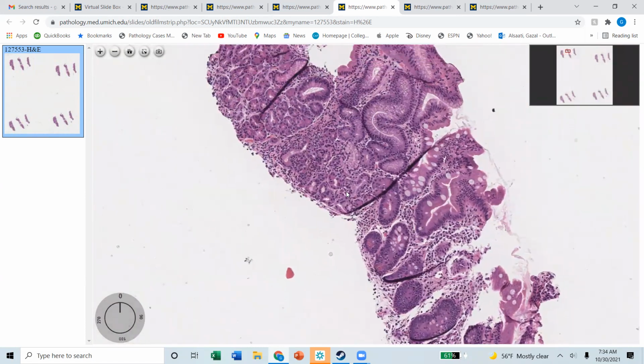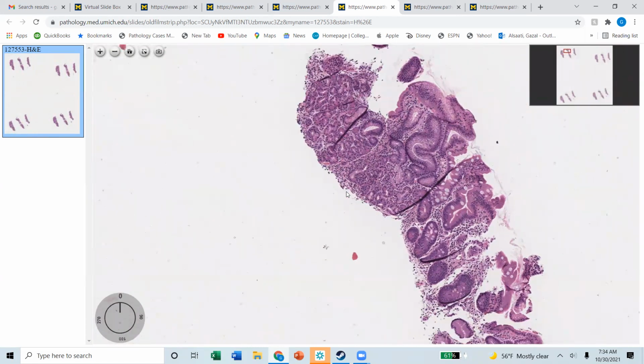Okay. So not a lot of people use the word antralized. Antralized is just telling me that I could not differentiate between an antrum and a body. One of my fellowship mentors used to use that. It actually justifies his gastrin stain, because when he uses antralized, it is because he cannot tell that this is a body biopsy.